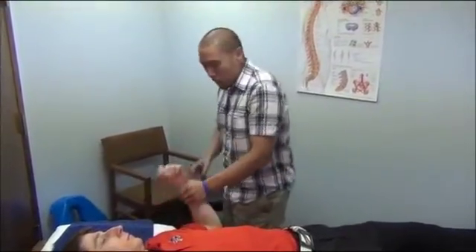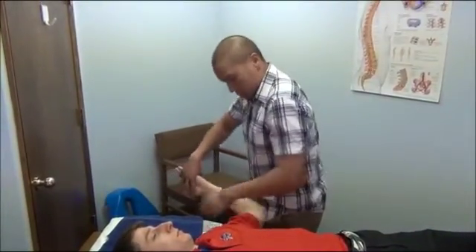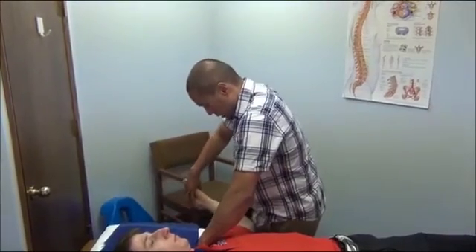So I just want to show you a demonstration of a new way I came up to use some compression wraps or the Edge Mobility bands. So out here is some limitation in median nerve mobility. And I have not done this yet other than a test.